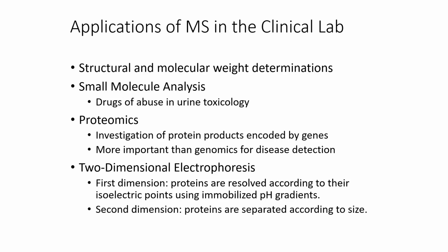Applications of MS in the clinical lab. MS is used for structural and molecular weight determinations, and small molecule analysis, such as drugs of abuse and urine toxicology.